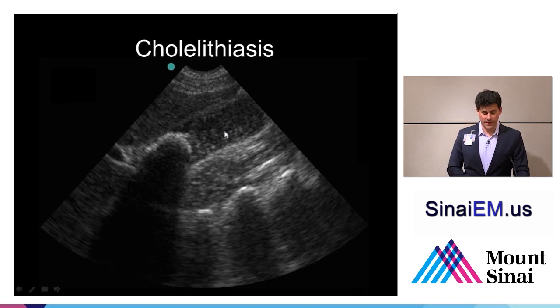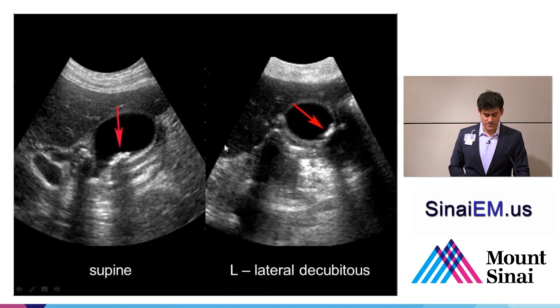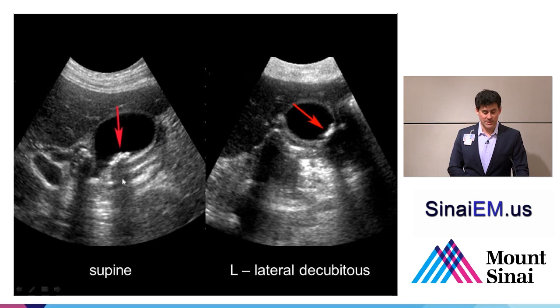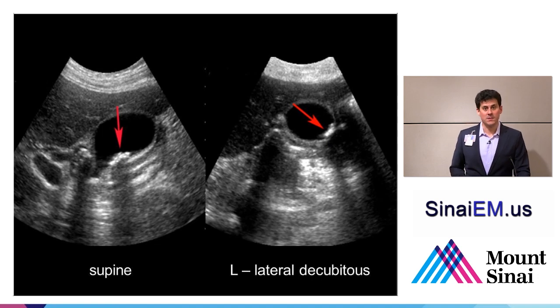Here we see another gallbladder in a longitudinal view — long from the gallbladder's perspective — with the fundus up here, towards the neck down here. There's a large stone or group of stones, and we only really see the anterior leading edge with shadowing coming down behind it. The portal vein is visible, and there's some debris or sludge inside the gallbladder. Stones normally should be free-moving. If a suspected stone isn't moving, it could be an impacted stone or it could be a polyp.